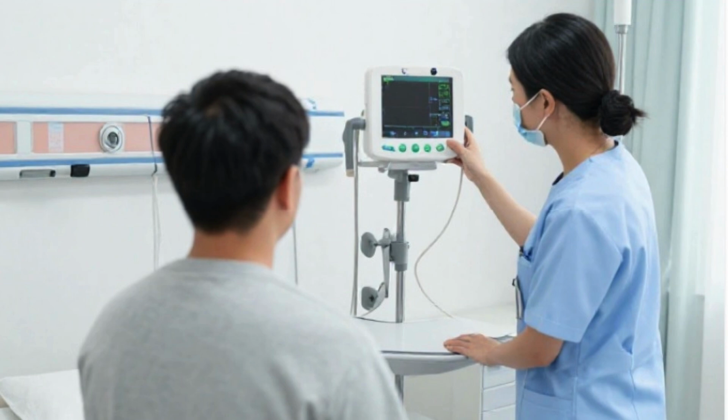A patient monitoring system is a medical device designed to measure, display, and record physiological parameters in real time. These parameters typically include heart rate, electrocardiogram or ECG, blood pressure, oxygen saturation, respiratory rate, and body temperature. By monitoring these values continuously, healthcare professionals can quickly detect changes in a patient's condition and respond appropriately.